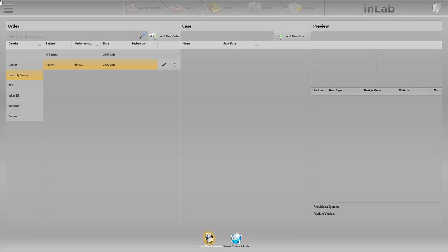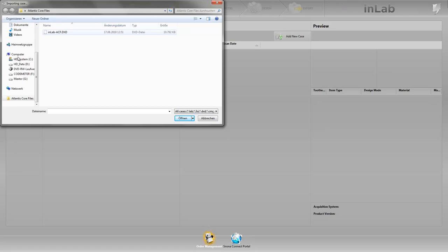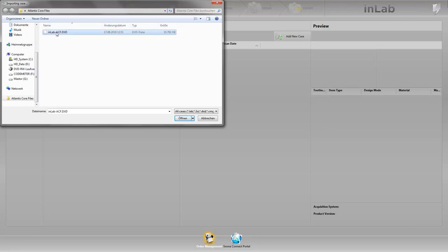After we have downloaded and saved the DXD file Atlantis core file from the Atlantis web order page, we first open the system menu and click import. The software automatically takes us to our drives. In our case the folder that contains the core file is already pre-selected. We mark our DXD file and click open.